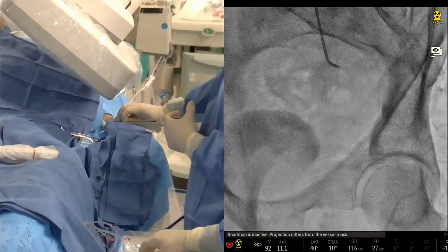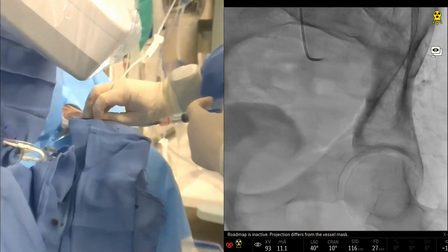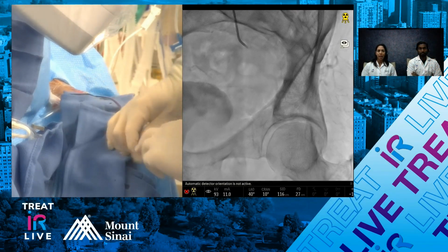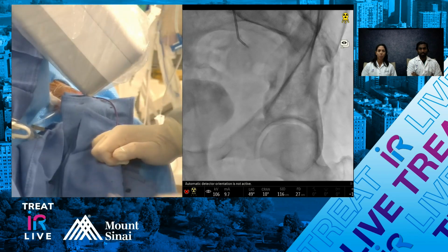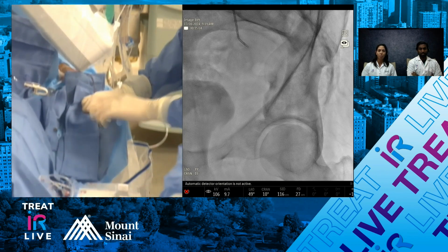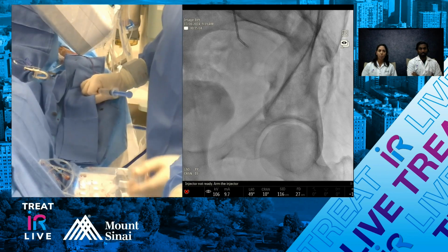Puneet had a great slide showing the escalation approach. So you're looking at this angio, and are you still thinking that balloon occlusion is the way to go, or are you concerned that you may not be able to track it into that very tortuous prostatic origin?